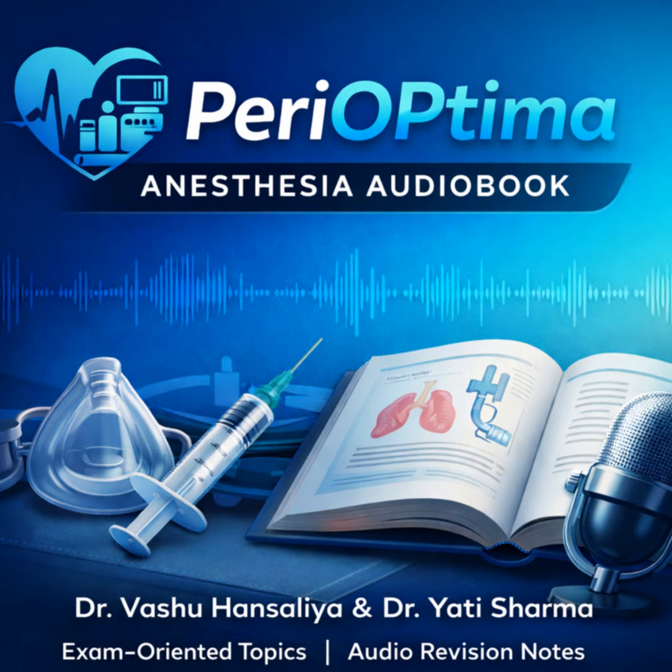And how does it do that mechanically? What's the logic? It's a really clever bit of pneumatic logic. The mechanism often involves a pressure sensor, like a little bellows or a diaphragm, that's connected to the oxygen line. This sensor, when it feels enough O2 pressure, holds open a safety valve, which allows the N2O and other gases to flow. But when the O2 pressure falls below that critical 20-30 psi, the diaphragm collapses, or the bellows retracts, and that mechanically and automatically shuts off the supply valve for the non-O2 gases. So the flow of N2O is directly dependent on having enough O2 pressure. It is completely dependent on it. So if I lose my O2 supply, I immediately lose my ability to deliver N2O.